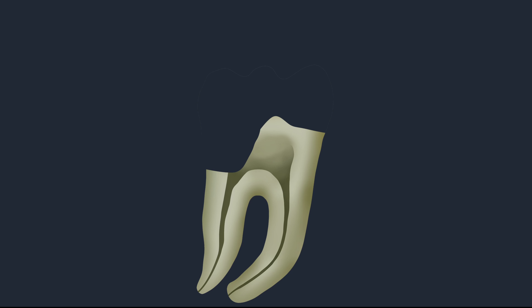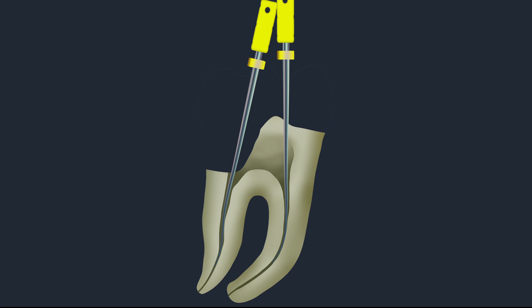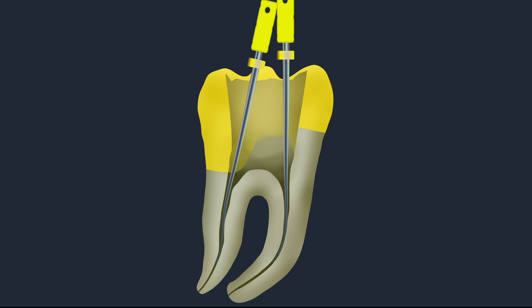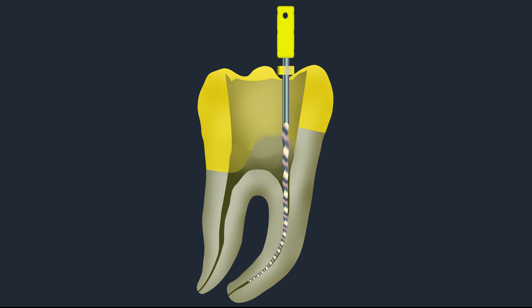A simple alternative technique is to use root canal spreaders. Take two or more root canal spreaders and bend them according to the canal curvature. Make sure you use stainless steel spreaders — never nickel-titanium spreaders. Care should be taken so that the spreaders exit in a position where the orifices can be placed, avoiding any acute curvature during root canal instrumentation. Once the spreaders are blocking the root canal orifices, the buildup is done with resin composite material. Then the spreaders are removed and we can proceed with cleaning and shaping.